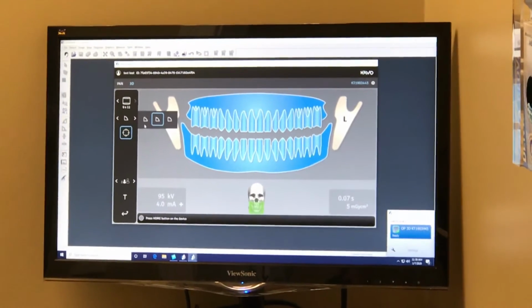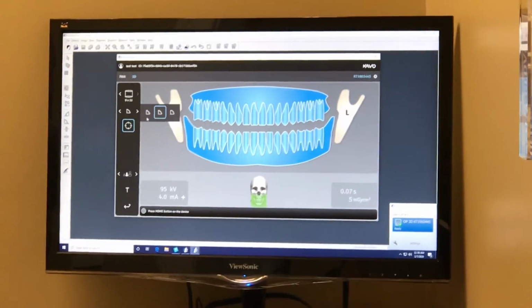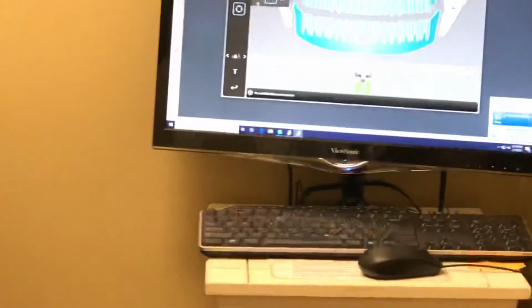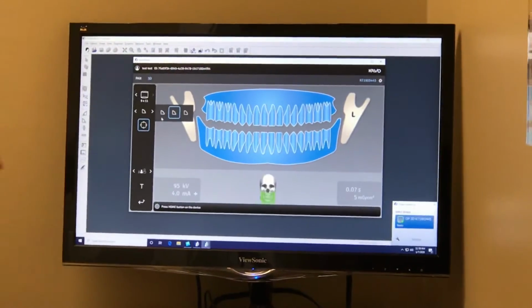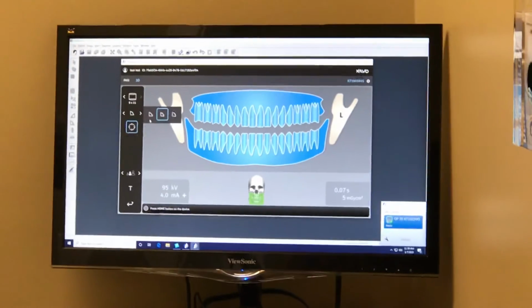Or if you're doing an airway scan, I would use low dose. Airway always shows up black in an x-ray. No need to use high radiation to get an airway scan. If you're going to use it for implants and things like that, I would use the high-res scan simply because it's going to give you the most amount of information. When you speak to radiologists, they all prefer to get high-res scans because they just see more data that way. If you're doing a general pathology exam of a patient, possibly just standard res.